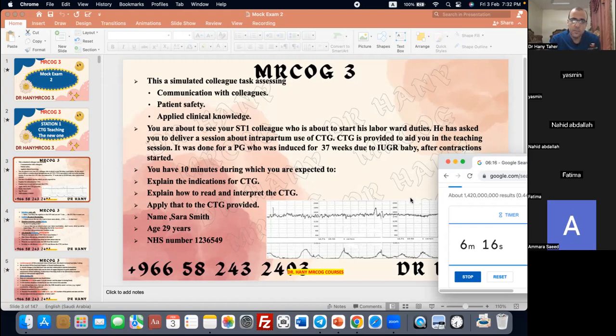So we are assessing. So after DR, it comes C. C stands for contraction. So we should assess in 10 minutes how many contractions are there. So if it is 5 or less, this is good. This is in the white zone. Okay. White. So in the previous one, we were calling it reassuring. So it is the same. It is the white one. And previously, they were not putting this contraction there. And then it is the amber. For amber, it is if the contractions are more than 5, or it is a sustained contraction, hypertonus, that lasts more than 2 minutes. Okay? Am I clear so far?